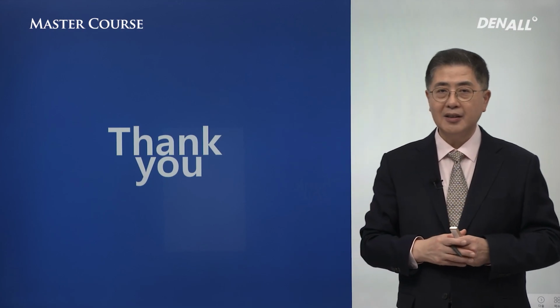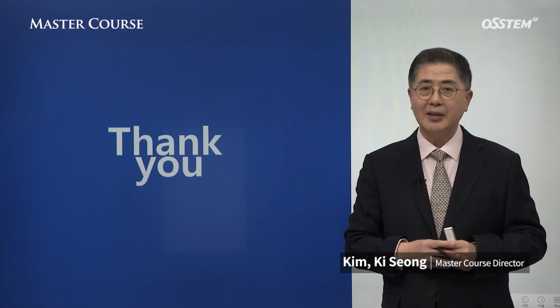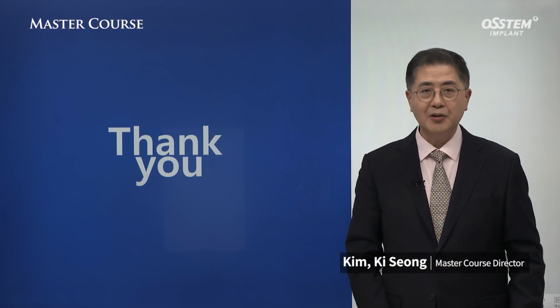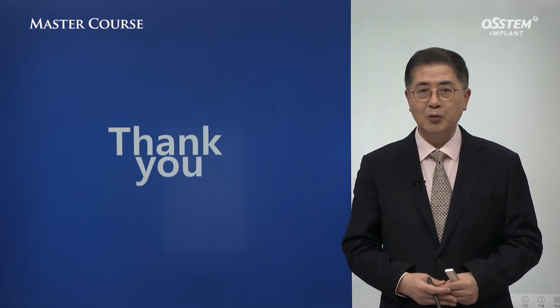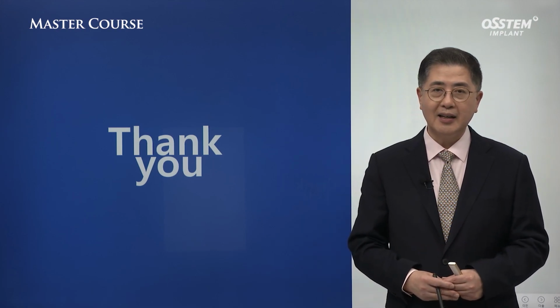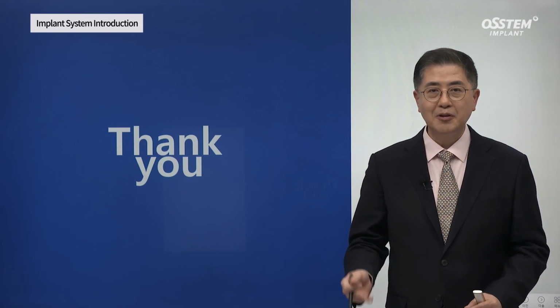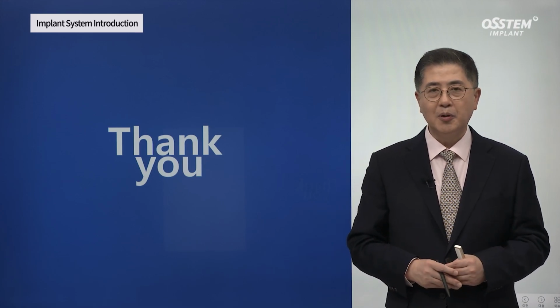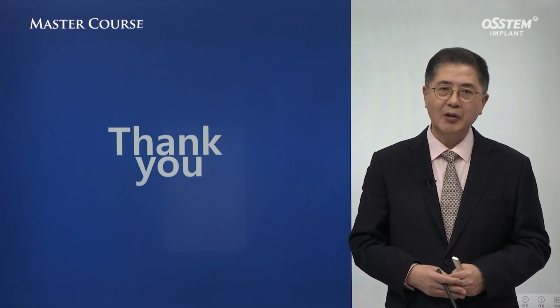Today I have briefly introduced different implant systems. If you're interested in more details, please come to the offline master course planned for February next year to get more in-depth knowledge. I hope to see you there. You'll be able to get significant knowledge and information as to how to use different implants. Then, you'll be able to choose the right implant system which lasts longer.